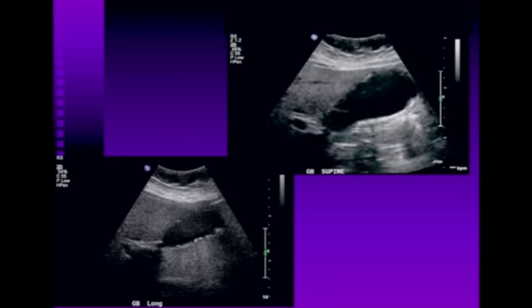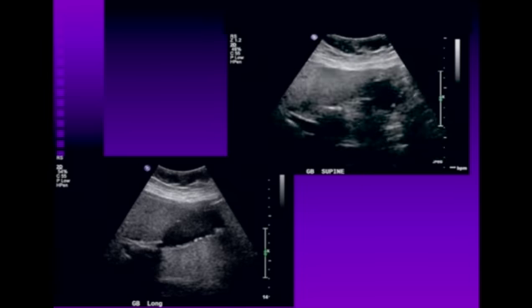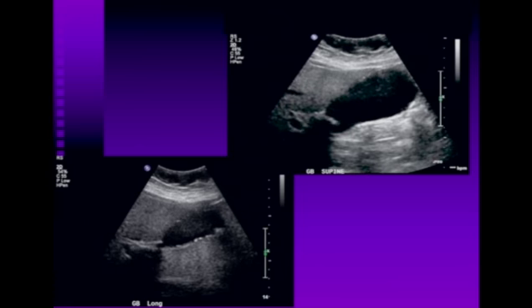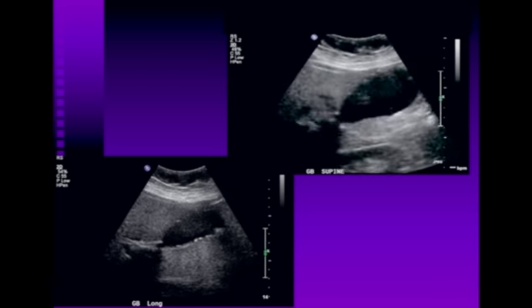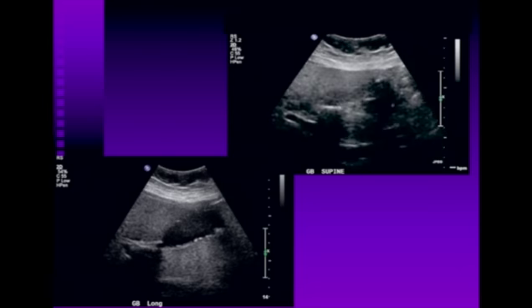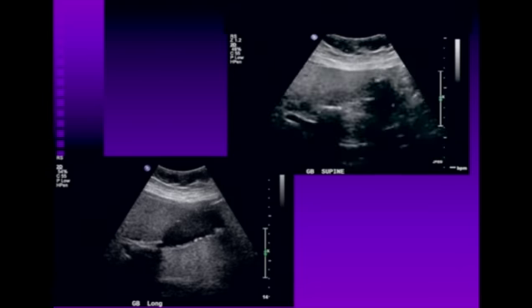Our next case. The difference between this case and the ones that we've seen is notice that all these echogenic calcifications, yes, they have shadowing, but these are not all in the dependent wall. These are on the anterior wall, they're on the posterior wall, they're fairly diffuse. So this is not typical of your standard stone disease.